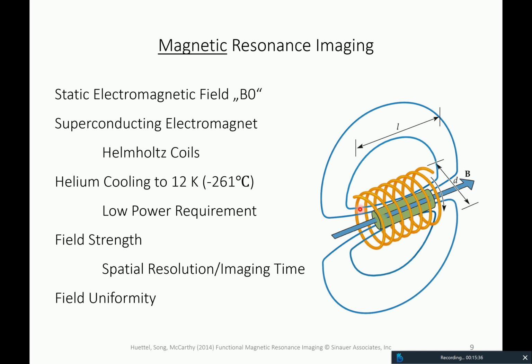What is quite important in terms of the physical maintenance of scanners is that the field remains uniform, and hence additional coils, and it's just important for the imaging process. We will go over details again to some degree, so just that you know that there's something called B0. It needs helium, and it doesn't require a lot of power.